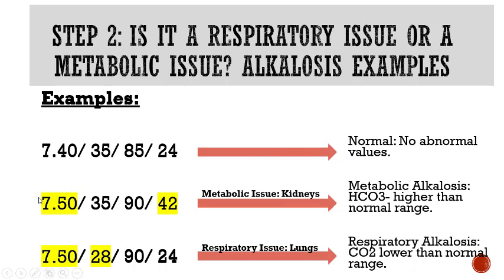You come down here, and the first thing that you notice is this pH is not normal. And it's alkalotic because it's above 7.45. So this is a high pH, it's alkalotic. When I go to this next value, well, that's in the normal range. You have a normal amount of acid. You're at 35. You come here, you have a normal oxygen.